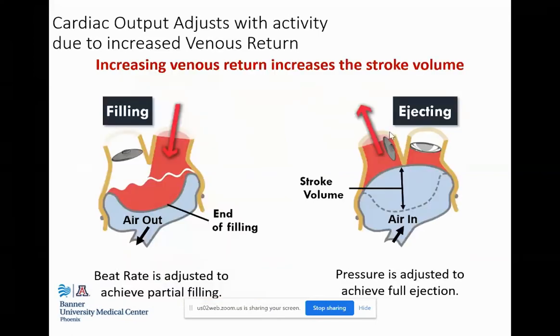This is a little bit of an image of what I was just saying about air coming in and out to provide that cardiac output. So the little yellow, that's our ventricle. Air comes out, the diaphragm drops, passive filling from the atria, air shuttles back in, pushes the diaphragm up, and then ejects the blood out to the rest of the body, providing their cardiac output.